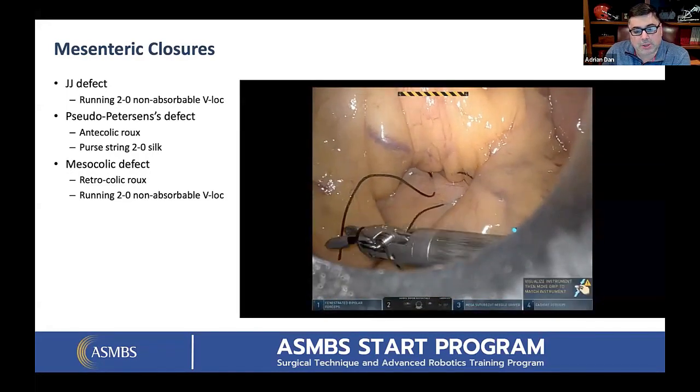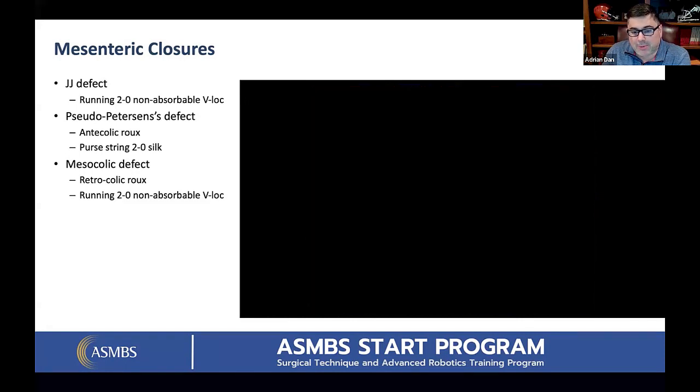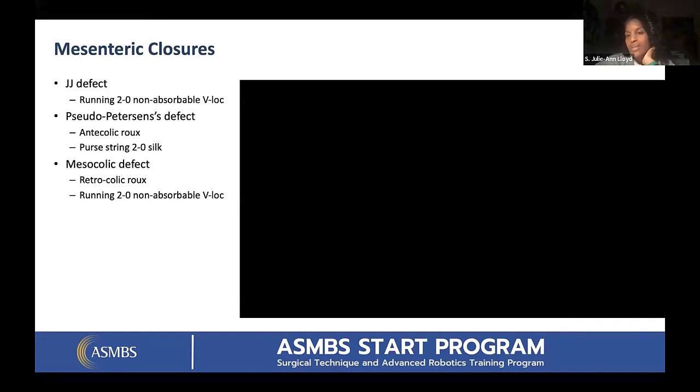So something to keep in mind. Now today, my fellow was trying to replicate a robotic operation laparoscopically. So we're starting to do that the other way too. The Omega loop: laparoscopic, robotic, use the technology where it shines. So does anybody else think that we tend to do that? Yeah, totally agree.